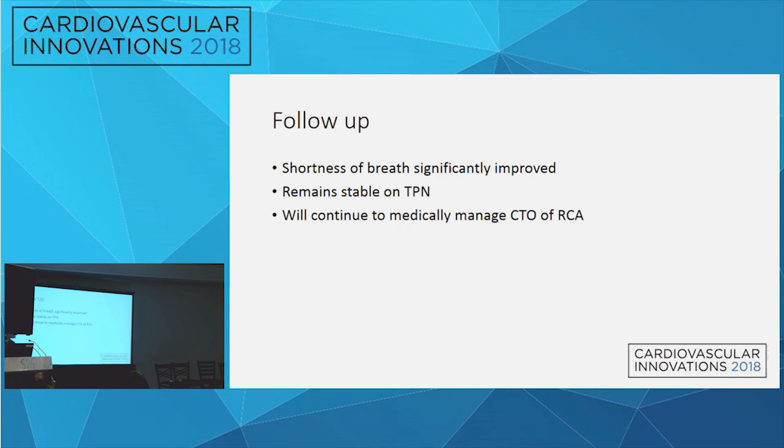The ultrasound is probably adequate. I mean, you can do it all the time for pacemakers, and you can see everything you're going after, the lung. So I think the DSA definitely works, but three-dimensionally, you can see it better with ultrasound. I feel like I can see the branches better, too. I have some idea where I'm actually accessing the artery to some degree.